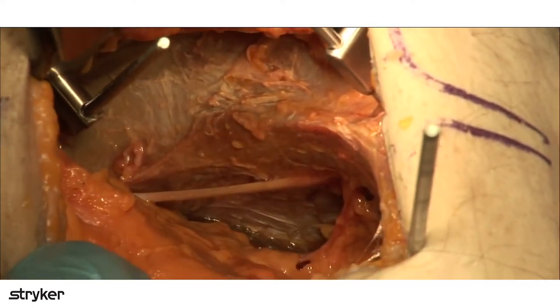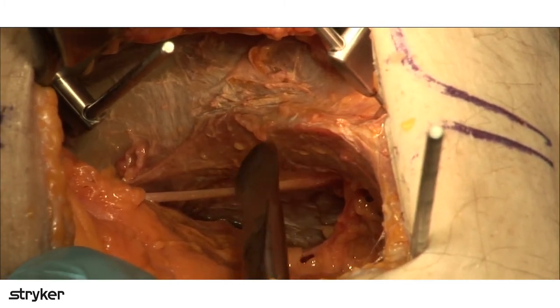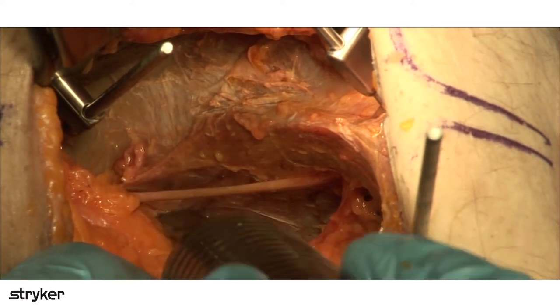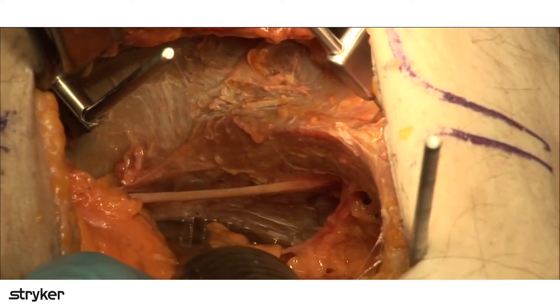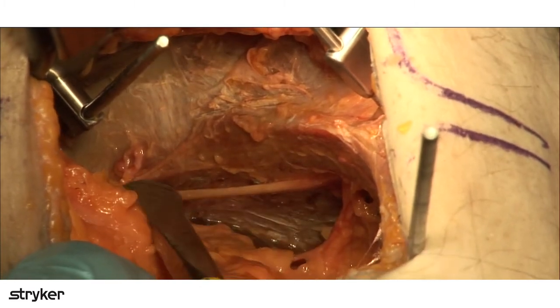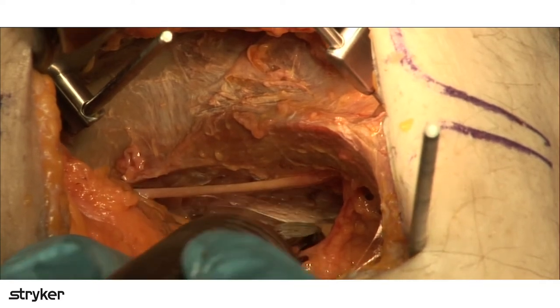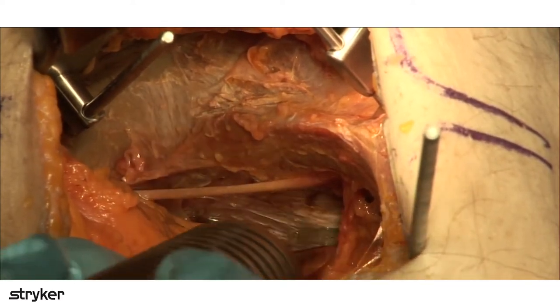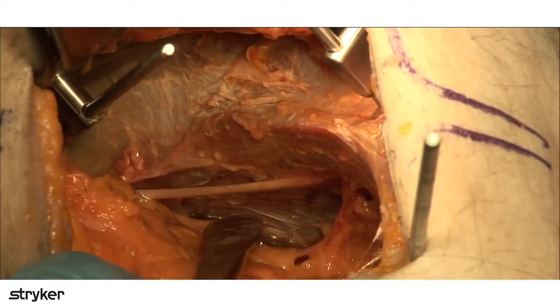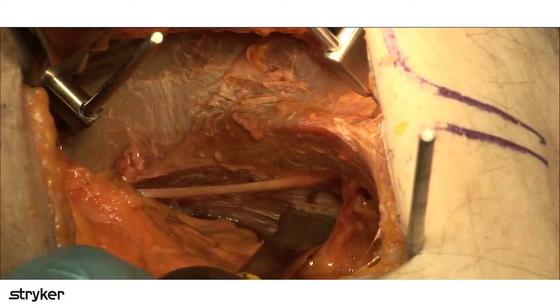The other thing that people don't often think about but is really good is that if you have a very high transverse or T or any fracture that's high in the posterior column that exits up close here by the notch, you can see how you can do a posterior column plate from here all the way up here, coming up into the iliac fossa. So it's a posterior column plate like you would do externally, but we're doing it internally instead. And you can put screws all along the posterior column here, and it's all posterior to the acetabulum. This is not aiming into the acetabulum.